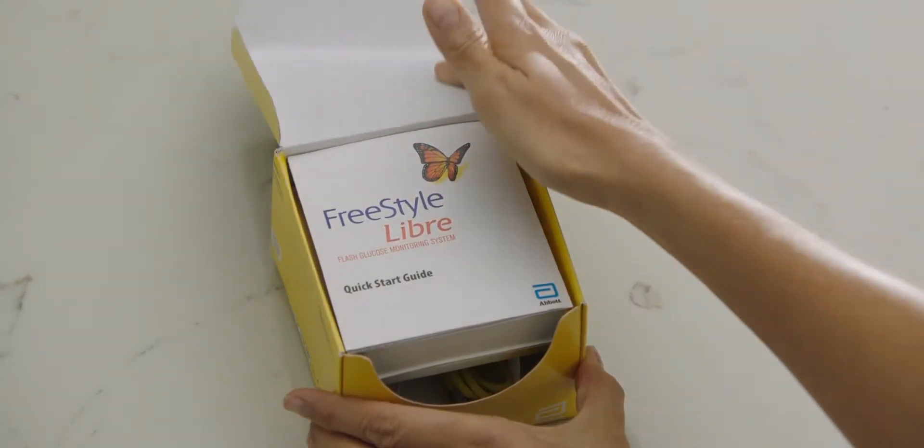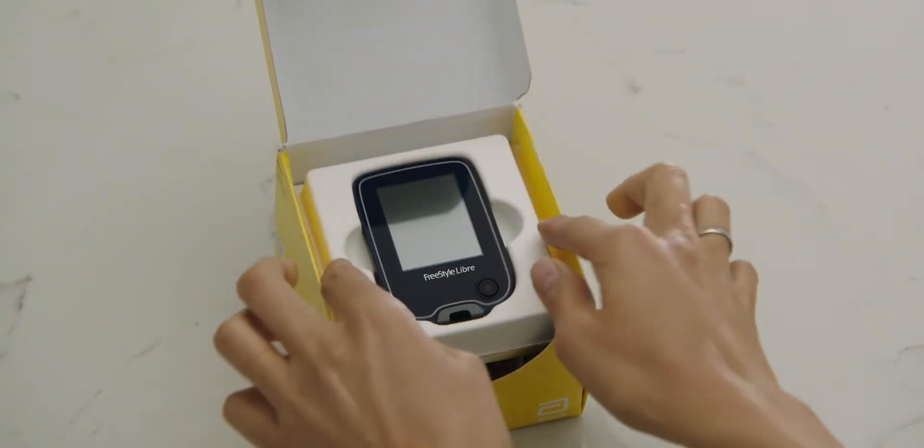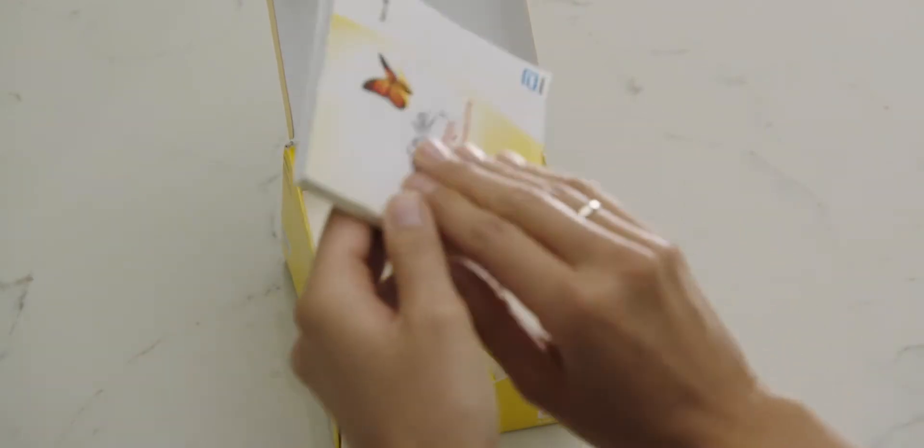Getting started couldn't be easier. Set up is quick — just watch Helen. When you open your new FreeStyle Libre reader kit, you'll find the quick start guide, the reader, the user's manual, a USB cable and power adapter.